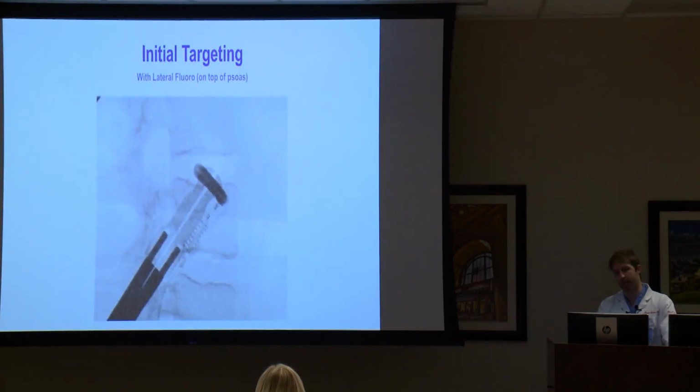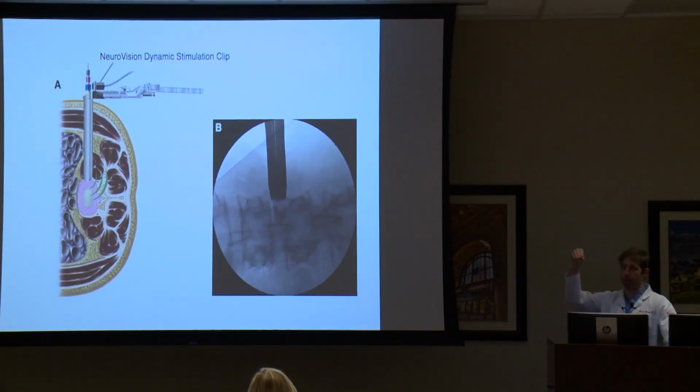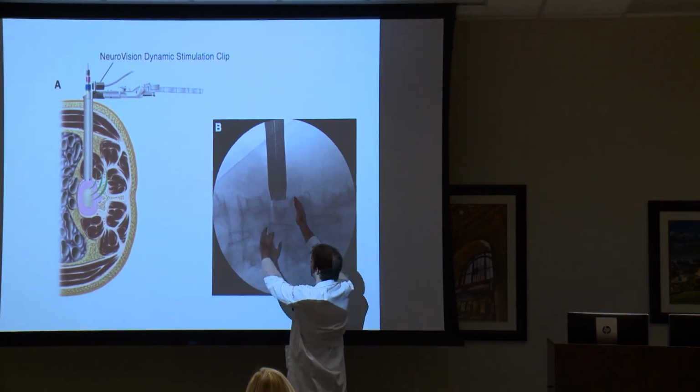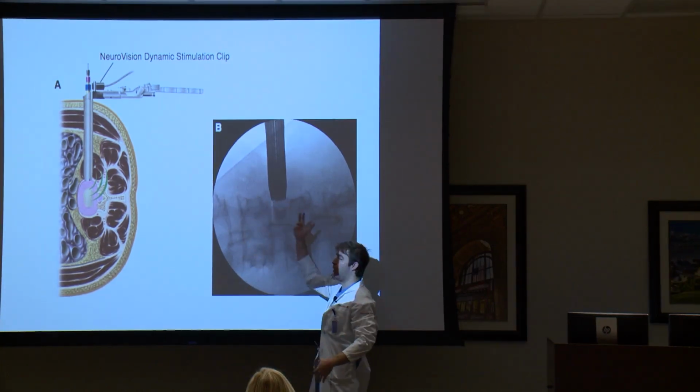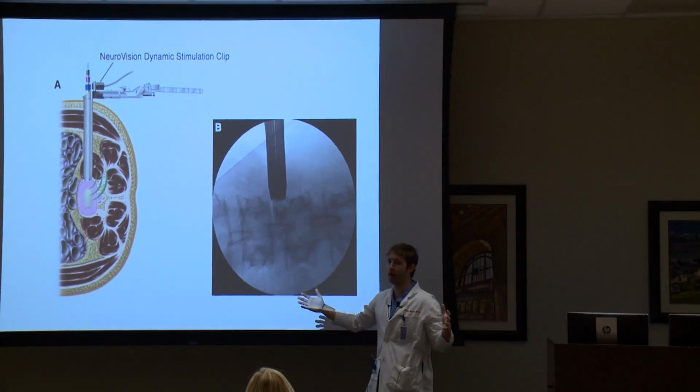But when you put that probe down like this, you then take these dilators, which are essentially larger size tubes, and you just lay them down on top of each other. And so you've got your one spot, and then it just slowly opens it up wider and wider and wider. And as you put that down, you then put down your retractor itself on top of that last dilator, and you should get a picture like this. And so you can see that retractor is kind of coming down, and what happens is I'm going to open it up, and so when it opens up, it's going to be like this. So all the muscle, all those layers, all the retroperitoneal tissue that you can see on that picture is out of the way.